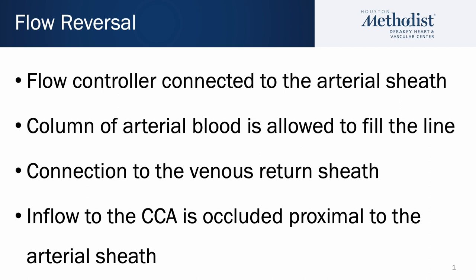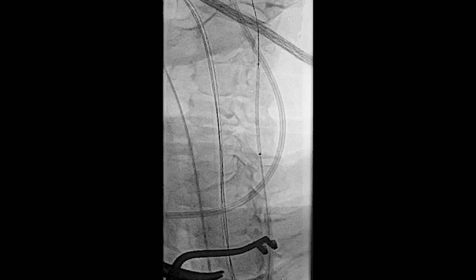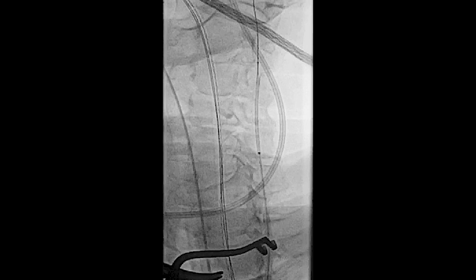To ensure reverse flow, we tightened the umbilical tape on the common carotid artery proximal to the arterial sheath. The lesion was crossed with an 0.014 guidewire and we performed primary stenting with a 10x40 mm ENROUTE transcarotid stent.